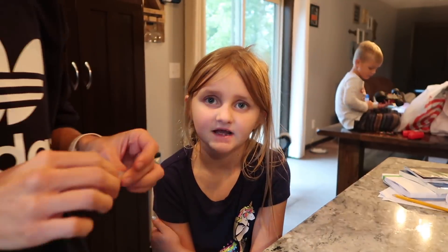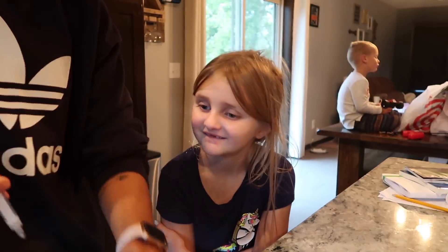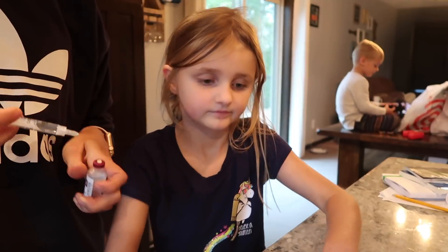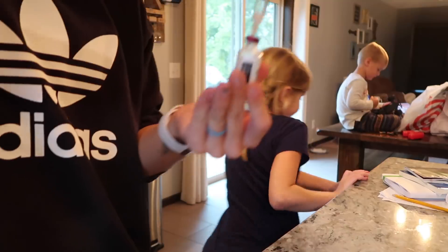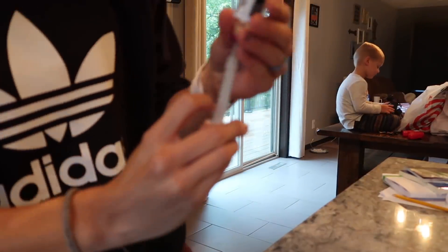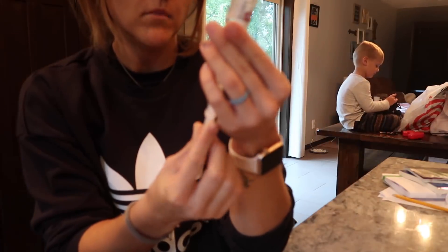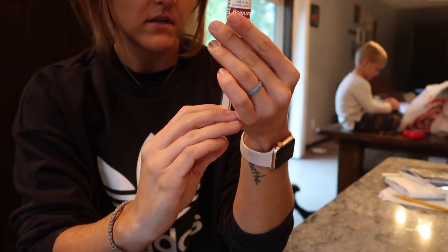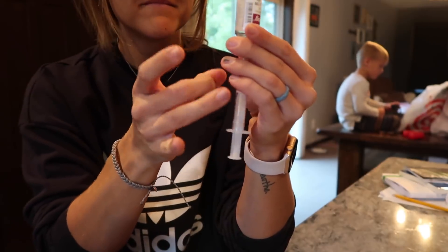I know, but we've just done it on your leg so many times. I think we should... I know, I can't even take it off. I want to put it in. Where's your PDM? In the back there. Go get it. I'm looking for it in here. Eve, I don't know if we have enough insulin in this one. I hope we do. Just enough. So what did you pull it back to? 1.5? Yeah.